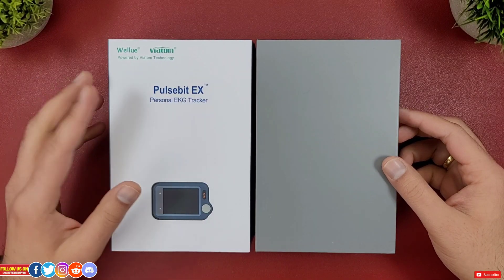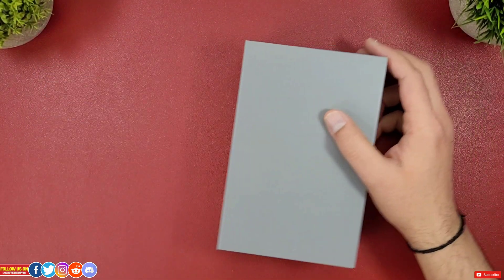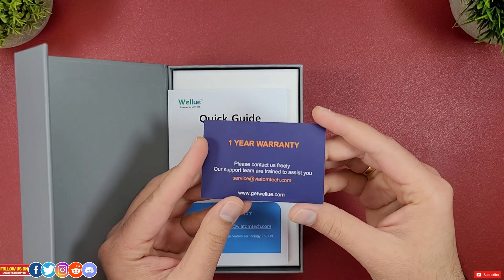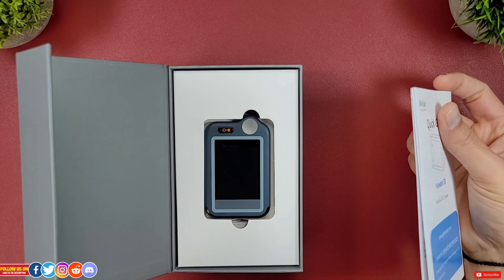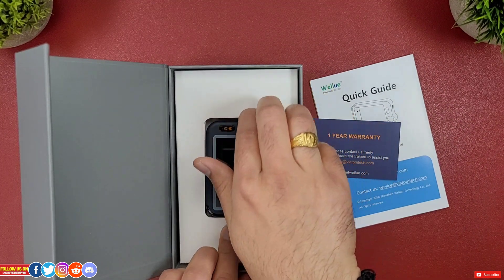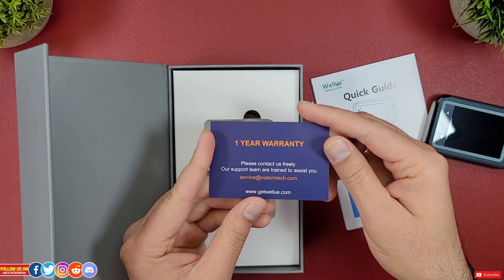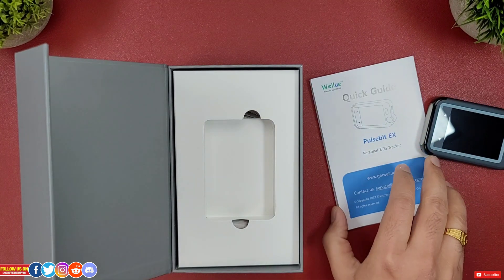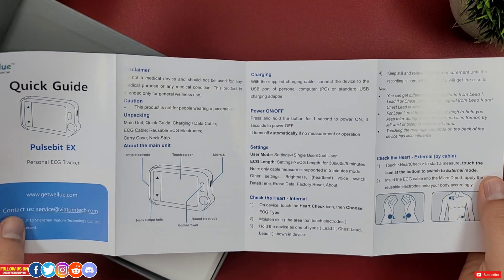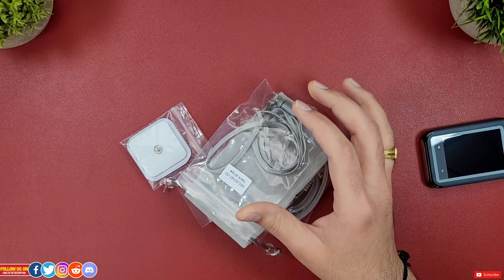In terms of unboxing, it's pretty good. There is a sleeve which houses the box with a magnetic closing lid. Inside the box there is the Pulse Bit EX ECG monitor — ECG or EKG are abbreviations of electrocardiogram and are used interchangeably. There is a one-year warranty card with customer support email, and a quick start guide entirely in English, quite legible, concise, and easy to interpret.